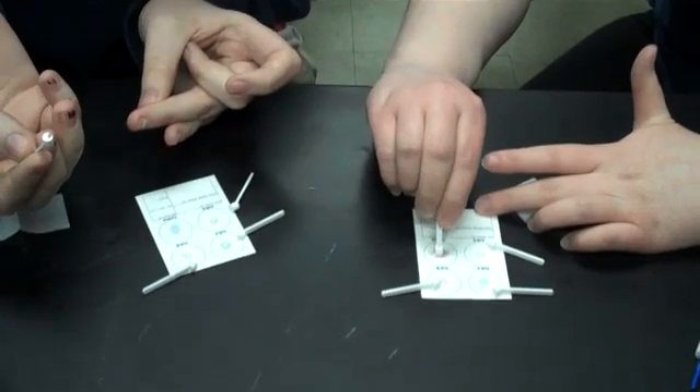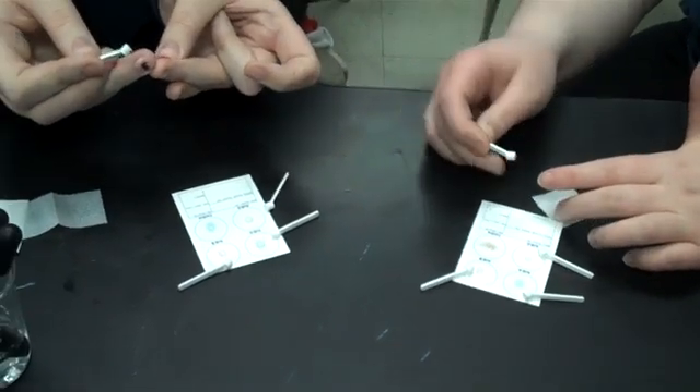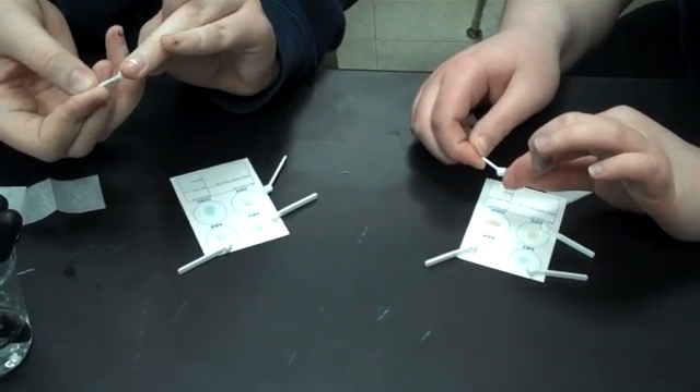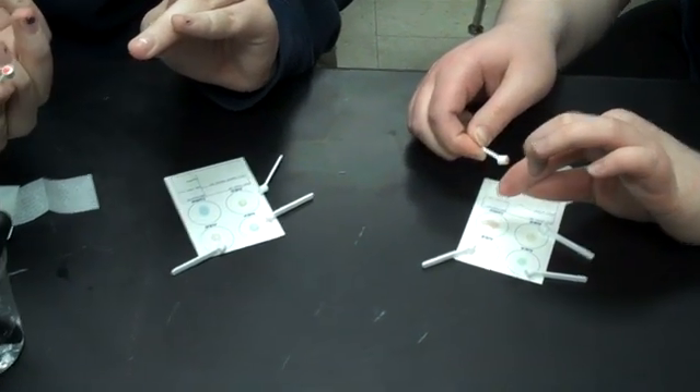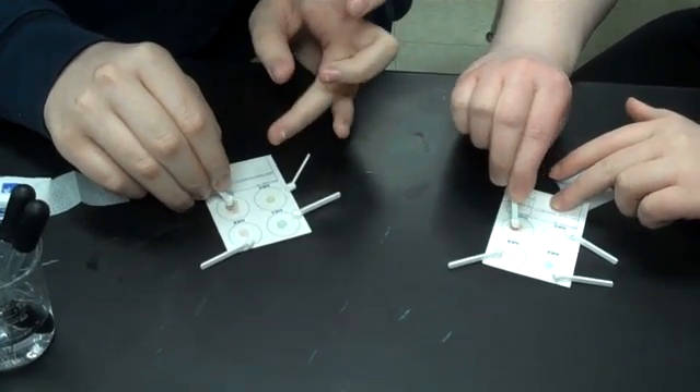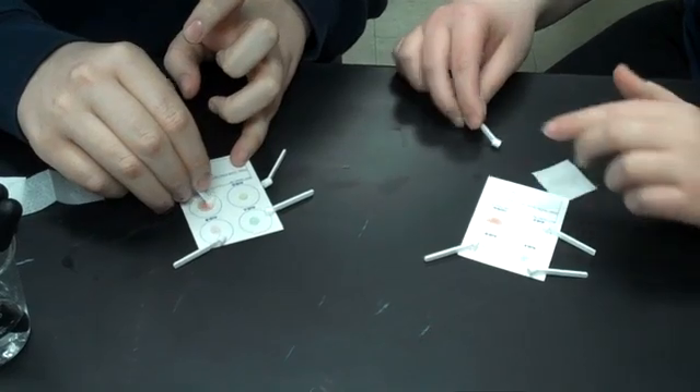That looks a little better, Stephanie. You might want to use gravity to your advantage — flip your hand over so it drips down. There you go, that looks better. Go ahead and put that on there, swirl it around, and then get a sample using the other sticks for the other spots.